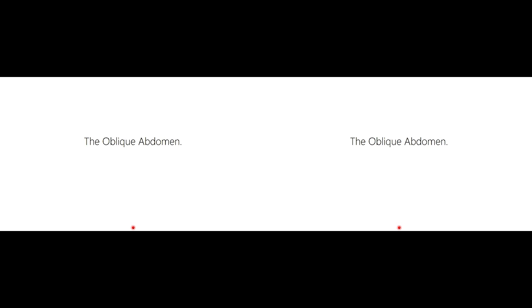and the fallopian tubes, okay? Because the kidneys do not sit in a perfect AP plane. The fallopian tubes do not arise from the uterus in a perfect AP plane. And the last structure which we'll occasionally perform an oblique projection for is to have a look at the VUJ, or vesico-ureteric junction. For those people who have already done their tutorial, you should understand the significance of the VUJ. If you have not, then in the tutorial in an hour or two, we'll talk about that.